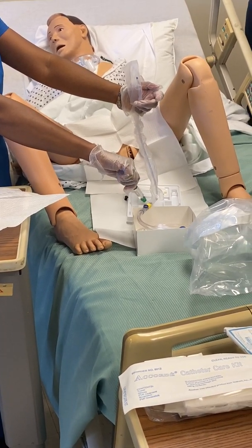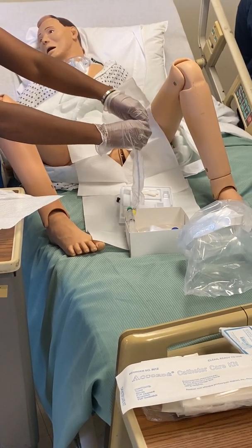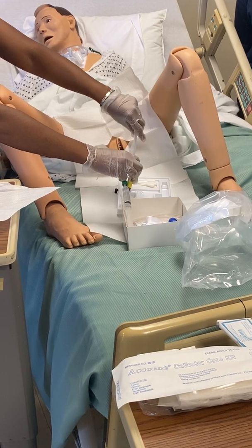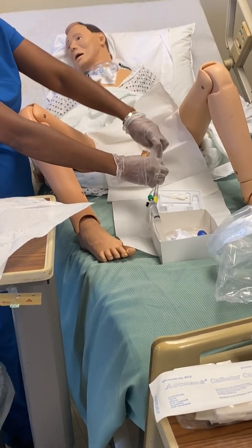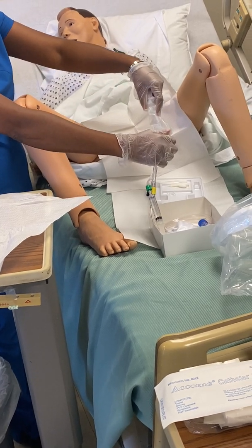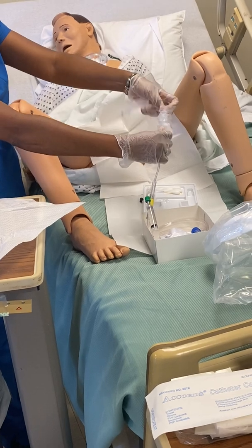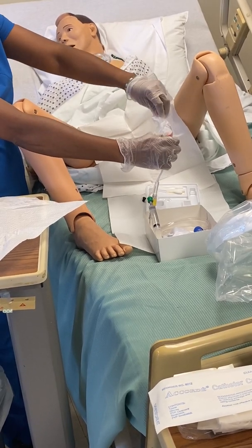Okay, I'm going to leave that in there. Now, I'm going to take this plastic off. Be careful, you guys, when you're dealing with this. That's how we can tell if you practice or not. Because if this thing comes out and it flaps and hits that leg, that's contaminated. Okay? So, you got to be careful with how you take it out.